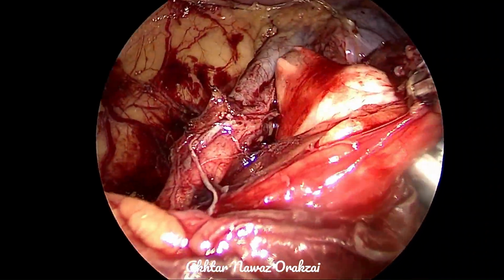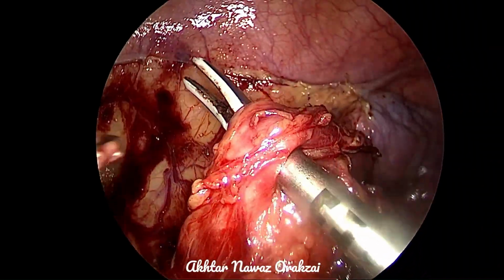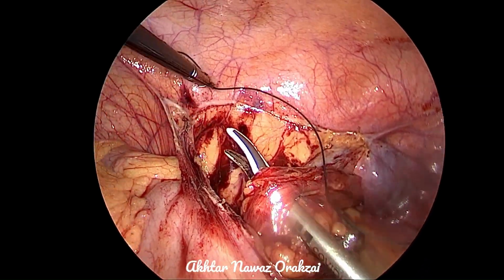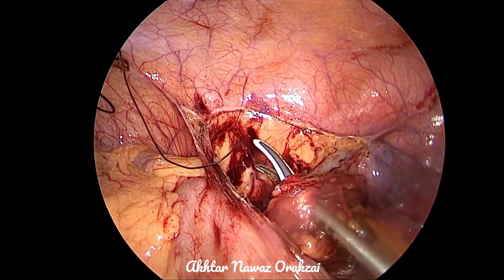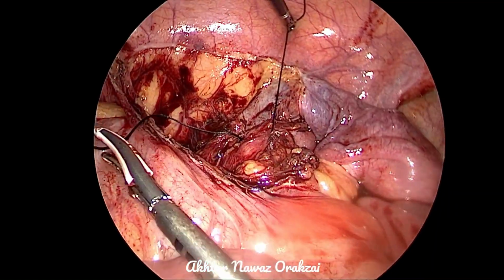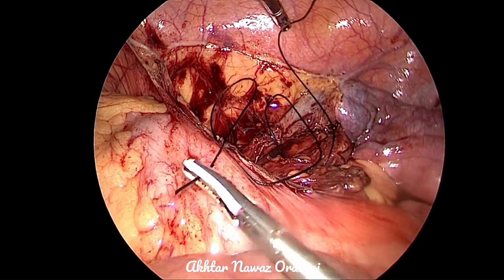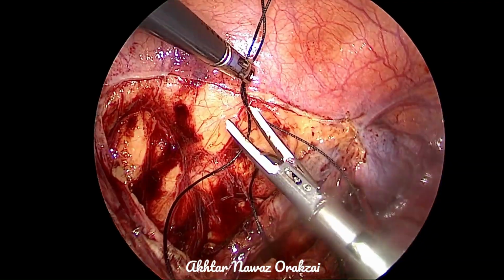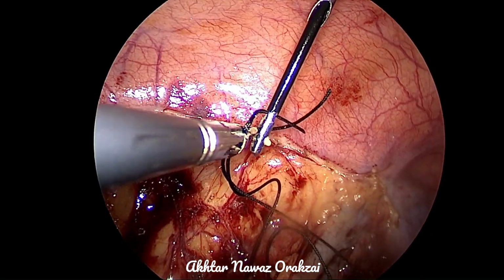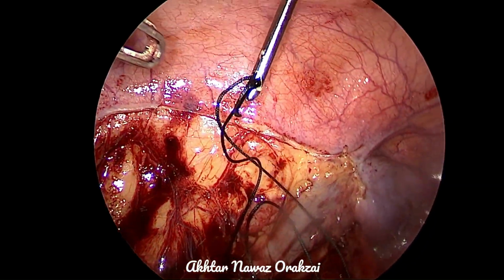So here we dissected the ureter enough now, and then made a window. In this window I usually place a silk, and then I create a small 2 millimeter hole in the peritoneal cavity, which acts like a small 2 millimeter port, and then I bring this loop outside and hold it with an artery forceps outside the abdomen.